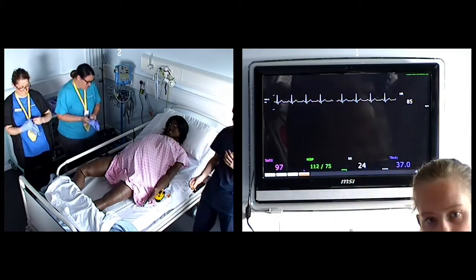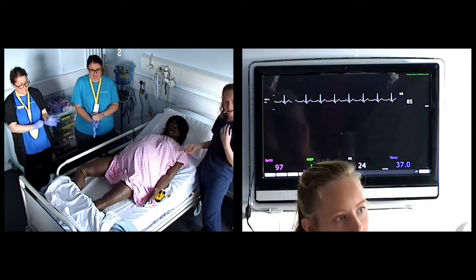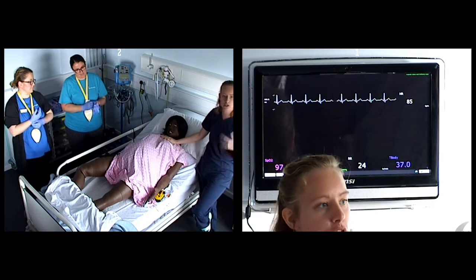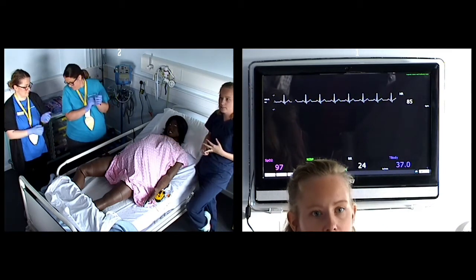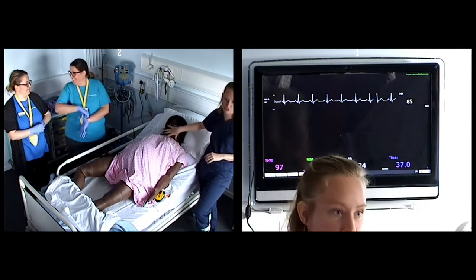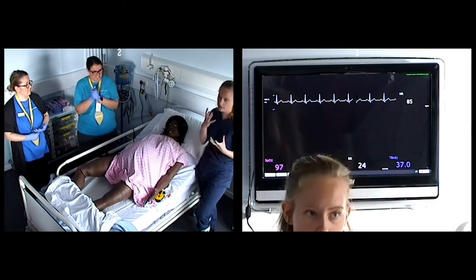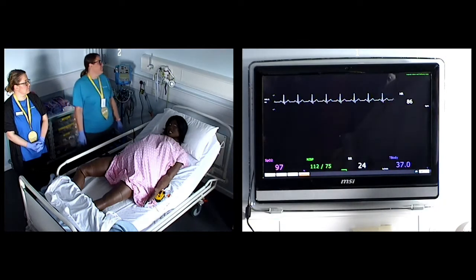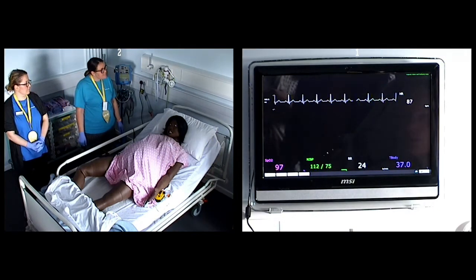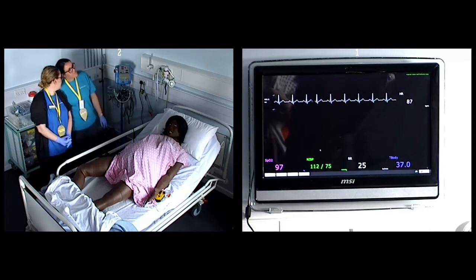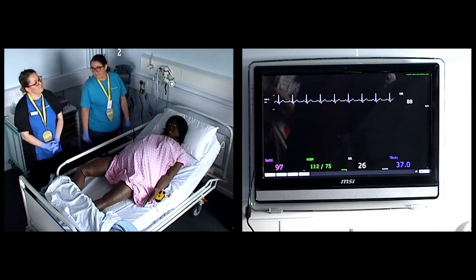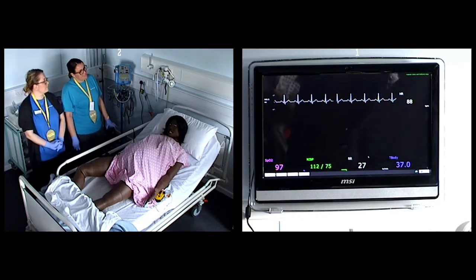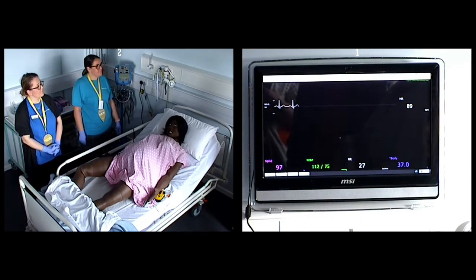In a scenario, students are encouraged to talk to the mother and the mother will talk back — the voice of the patient comes through her ears, so we have someone who plays the voice of the patient. She has heart and lung sounds, so we can add crackles and wheezes. You can run fluids through her, do defibrillation, ECG, CPR, and put oxygen on her. We have a head wall unit that's not hooked up to live oxygen but you can simulate that, as well as gas and air. From our monitor, we have maternal vital signs including heart rate, sats, blood pressure, respiratory rate, and body temperature.